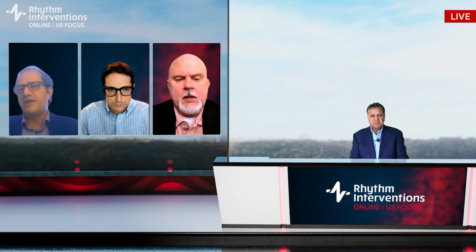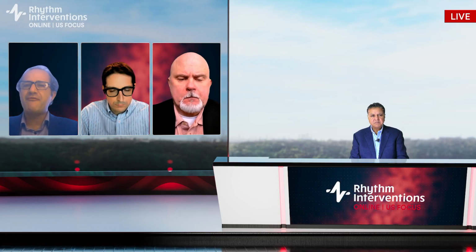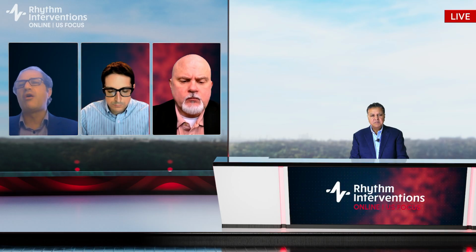The question for Rodney, do you use 50 watts or 90 watts based on the anatomical location, or personal preference? I personally like to drag and use the 50 watts modality and go around, and maybe go 90 watts in the posterior wall. But I want to know, what is your workflow, what do you want to say to the audience?